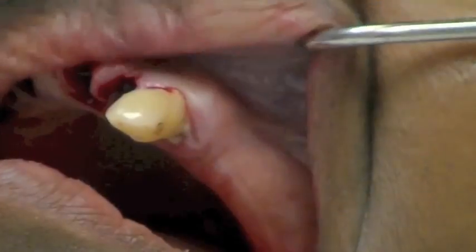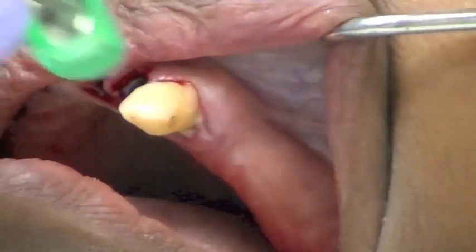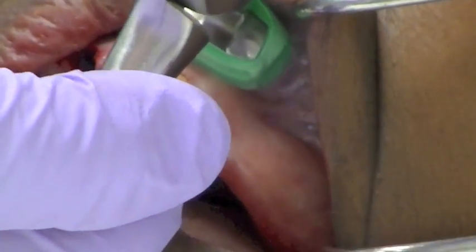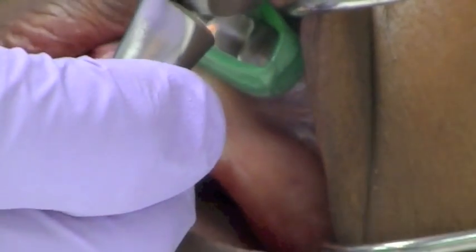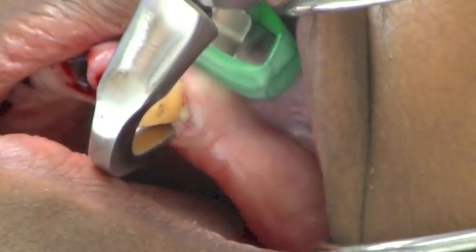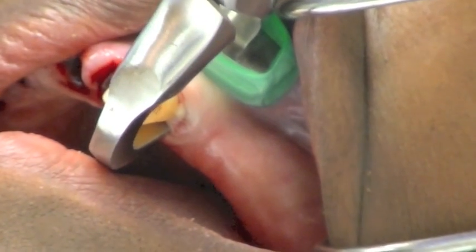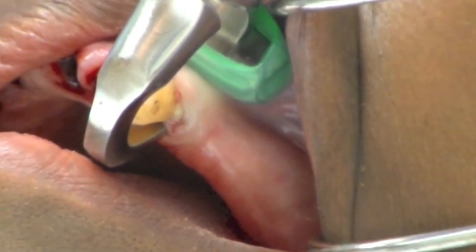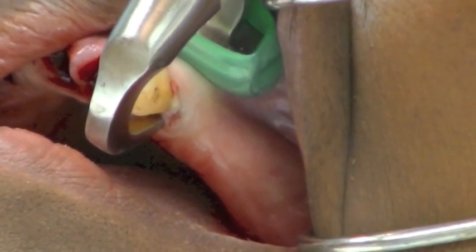Once you get movement of the tooth — one to three millimeters — you want to stop using the physics forceps and use a pincer-like device as shown here to simply remove the tooth from the socket, which completely preserves the bone when used properly. Again, the instrument handles should not be squeezed, and you use only an arc of rotation with your wrist until the tooth occlusively lifts up and out of the socket.